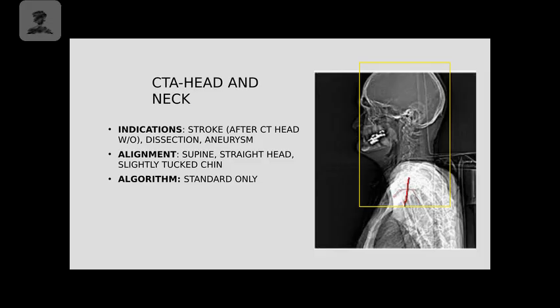So it'll start imaging from bottom to top as we watch the contrast flow up through the carotid arteries. And it will get into the internal carotids and then into the circle of Willis. So we'll watch all of that as it happens. We could identify an aneurysm. We could look at a dissection, a stenosis of some sort. So all those things are important with angiography.